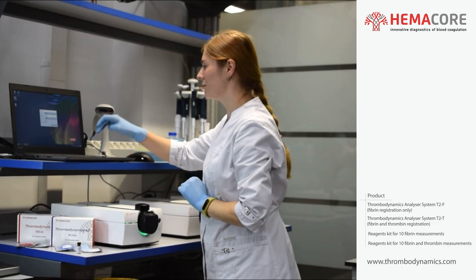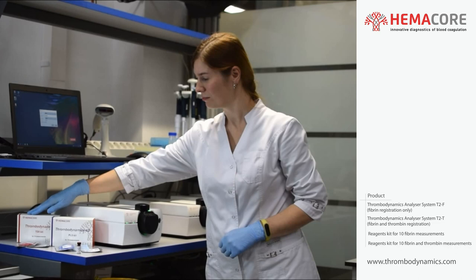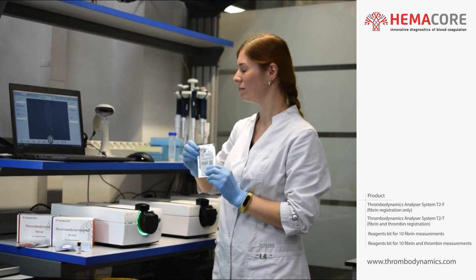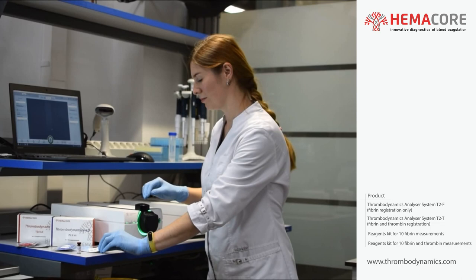We'll run the Thrombodynamics 4D PLS kit and the Thrombodynamics TDX kit simultaneously. Take the package with the activating insert and scan the QR code if available from its package using the laptop camera, or scan the barcode with a barcode scanner if available.